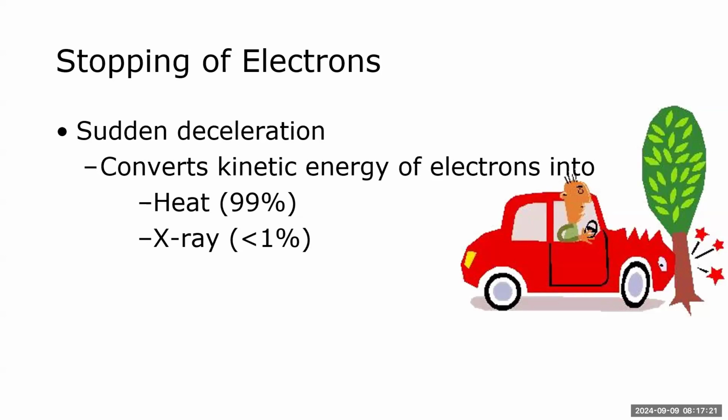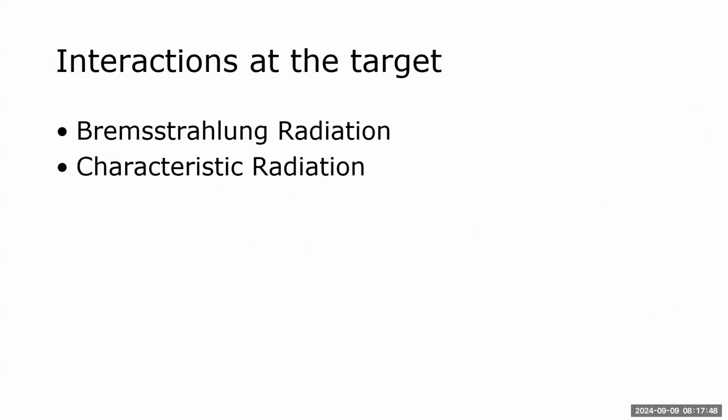That's why we have the insulating oil that's a part of that housing. And so it's not a very efficient process, is it? If only 1% of those electrons are turned into X-ray photons. A photon is a bundle of energy, but it's all we got. It's been that way since 1895 when Röntgen discovered the X-rays.